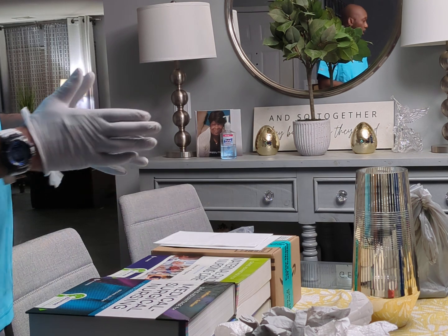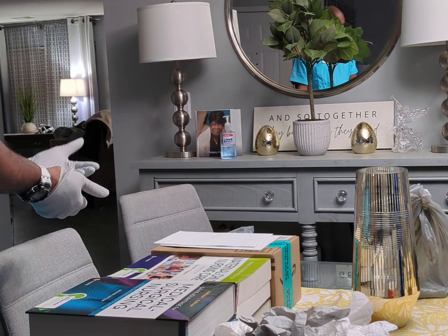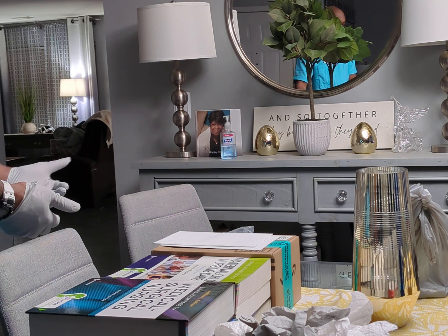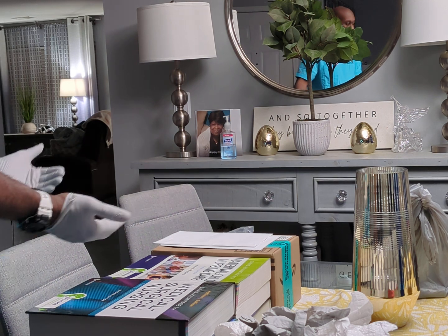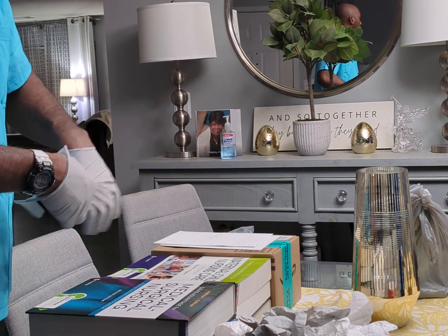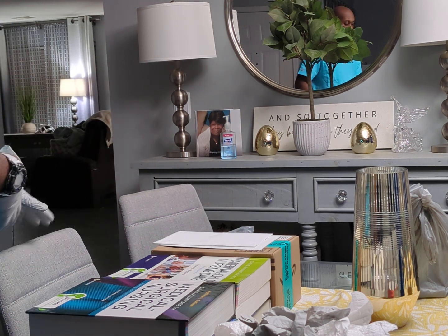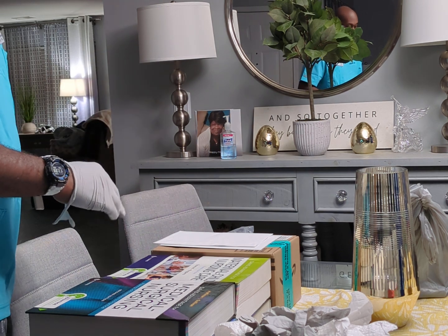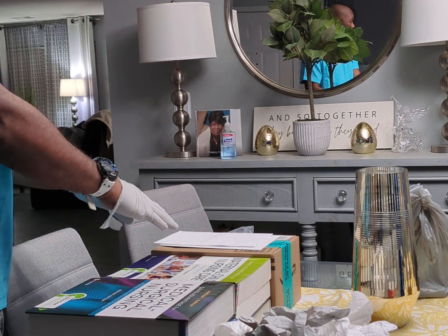Since I have not opened the kit yet, I would just place a chuck or a continence pad right here, right next to me, so that I can throw my dirty stuff onto that continence pad and get rid of it. People do different things.